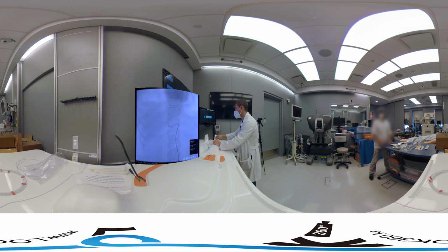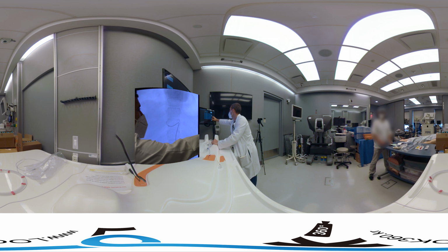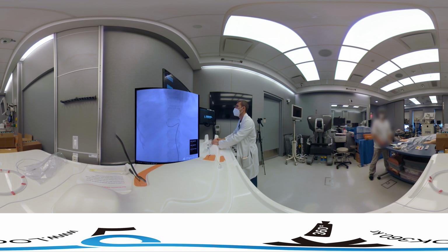What we're going to do is a little injection here, just to confirm where we are. So you can see near here the branch that we want to get into. And we're going to try to manipulate our microwire to get into that branch. And you can see that it's starting to catch right around here. We're going to bring the microcatheter up to there, and we're going to change a little bit of our wire angle. We're going to give ourselves a nice favorable angle to get into this branch. Come back just a little bit, and just a little bit farther here.